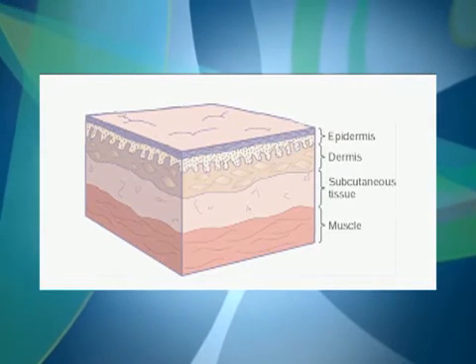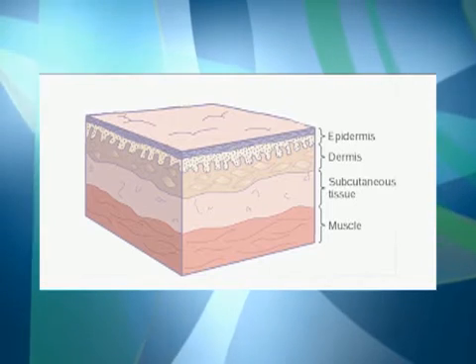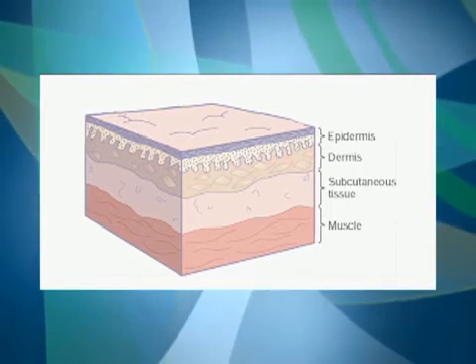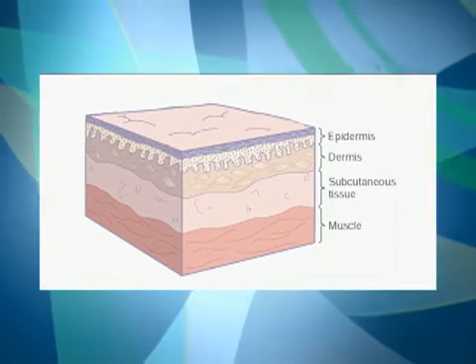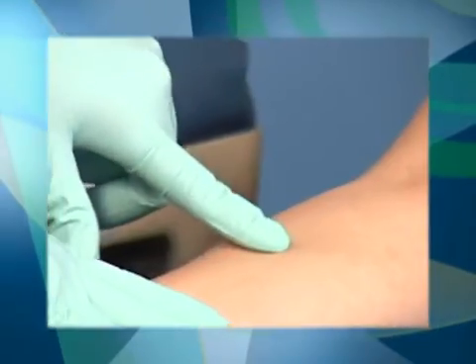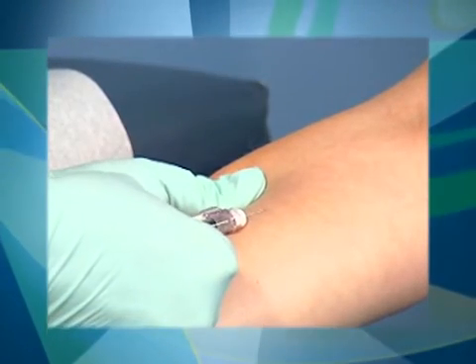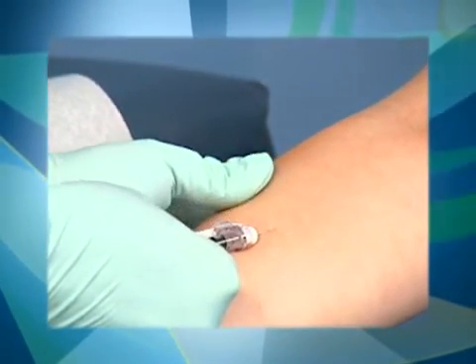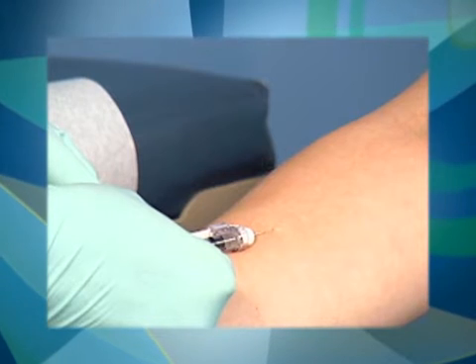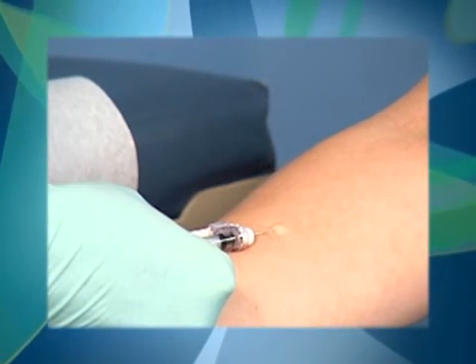An intradermal injection is given into the dermal layer of the skin at an angle almost parallel to the skin. Intradermal injection sites are areas where the skin is thin, such as the anterior forearm, the middle of the back, or the upper arm. The most frequent use of intradermal injections is to administer a skin test, such as intradermal allergy tests or a Mantoux tuberculin test.